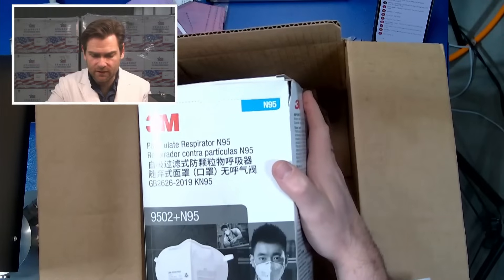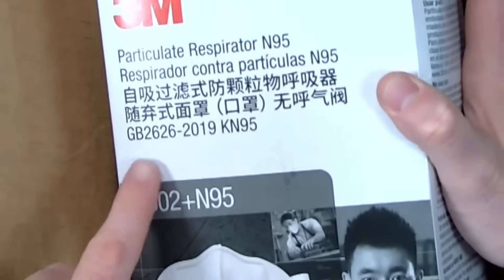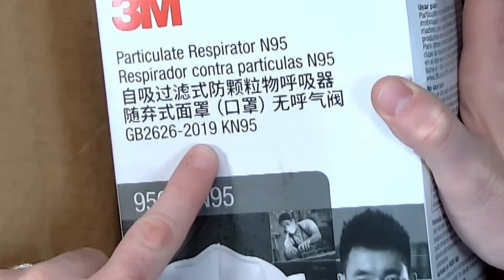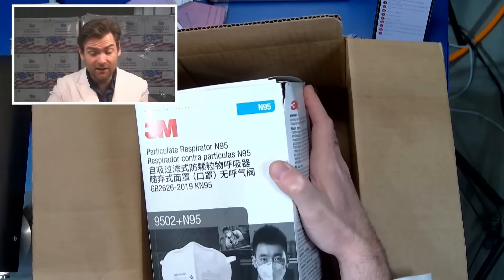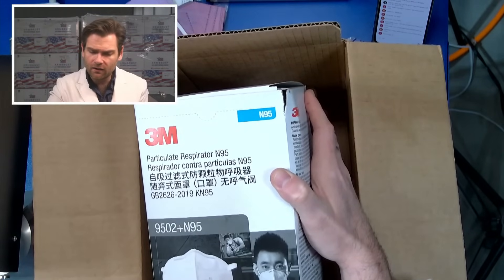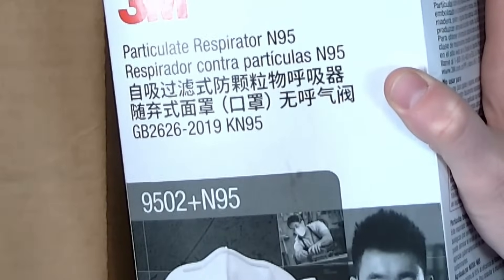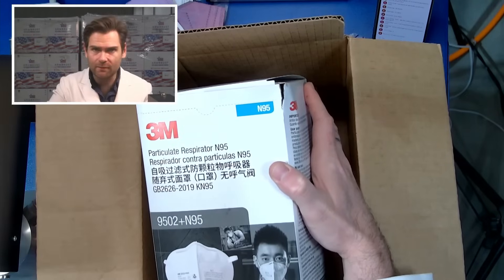Vasilis, this is so interesting because this seems like it should be that surgical respirator you're talking about. But look, it's the GB2626-2019 KN95. This is actually really cool. Wait, hold on — it says it's an N95 and a KN95? I've never seen that before.